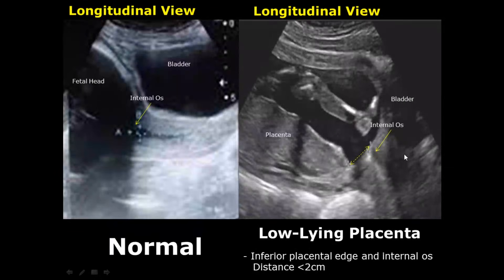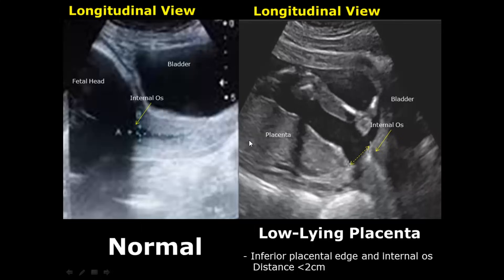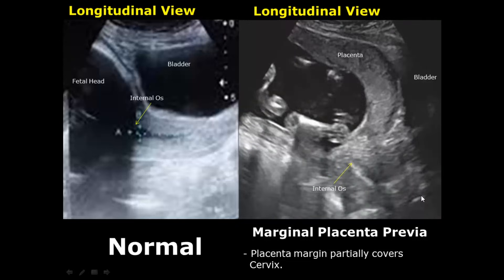Examining the location of the placenta is very important in determining whether the patient will have a C-section or a normal delivery. Over here is the cervix and this junction is the internal cervical os. You can see the fetal head — this is good because the fetus is in cephalic presentation. Over here we have the placenta that is very near the internal os; we have to measure this distance between the internal os and the placental margin. If it is less than two centimeters, then this is a low-lying placenta and a C-section will be needed.